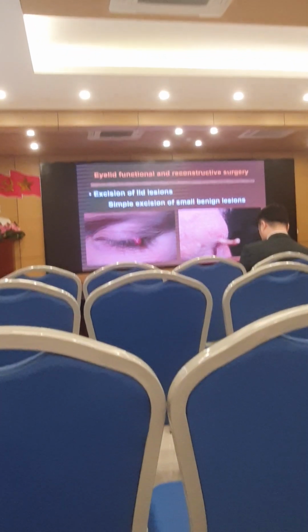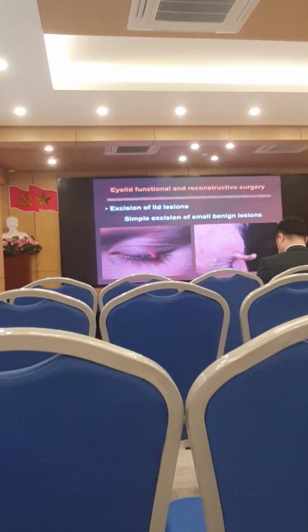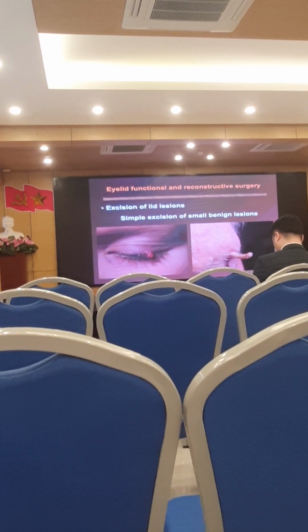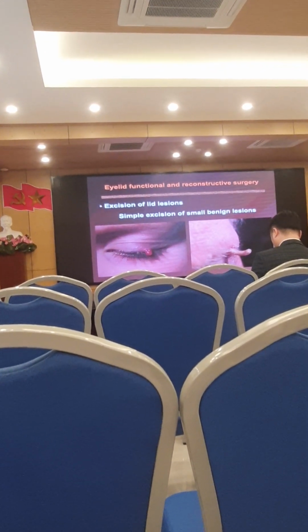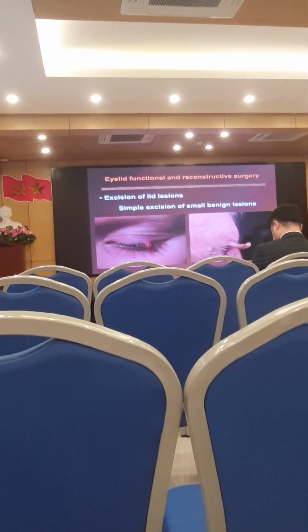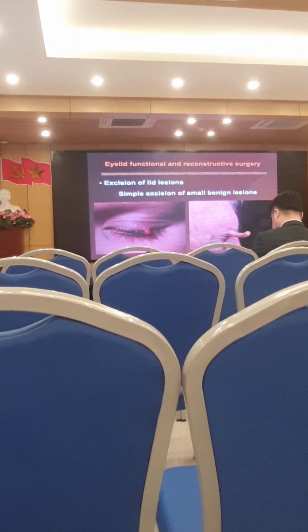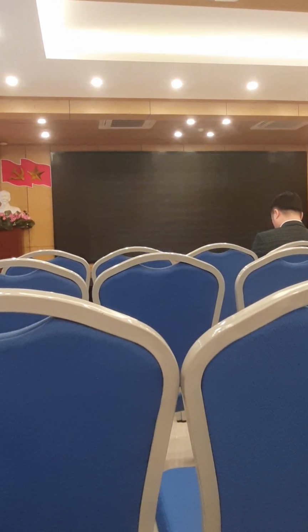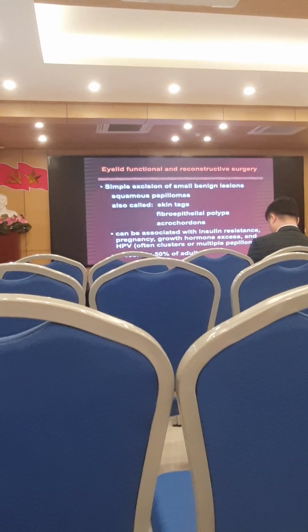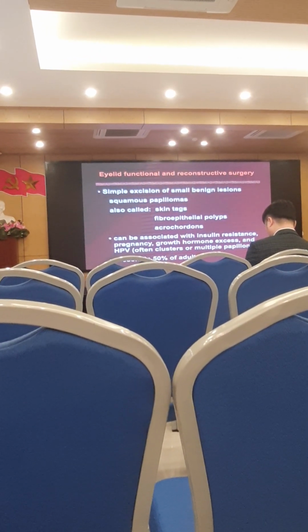If it's just a simple papilloma, I do not always submit that for pathology. But if it looks suspicious or I need to know the pathology, I will put it in formalin and send it off. But these simple excisions often just require excision, very light cautery of the excision site, and often you do not even need any sutures. And I'll just show you some examples of some of the simple benign lesions that we see in ophthalmology.